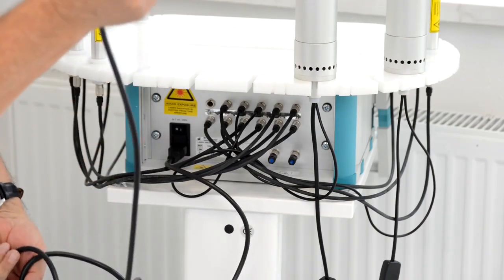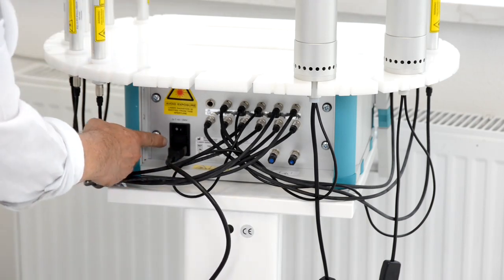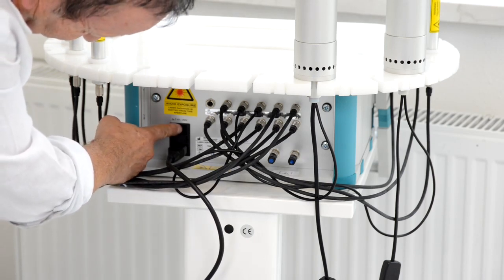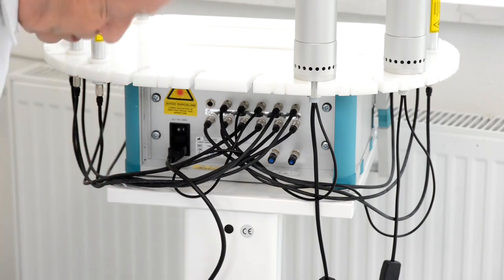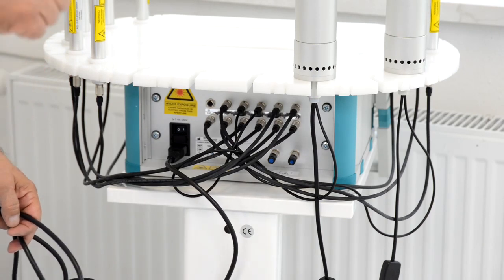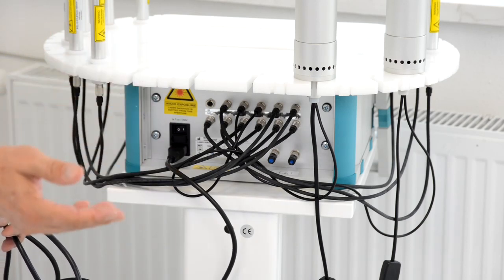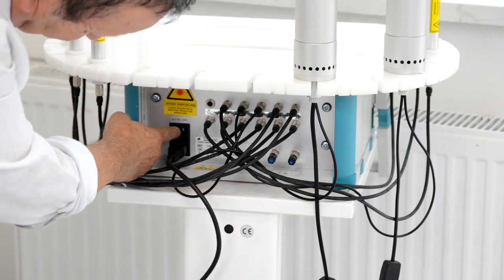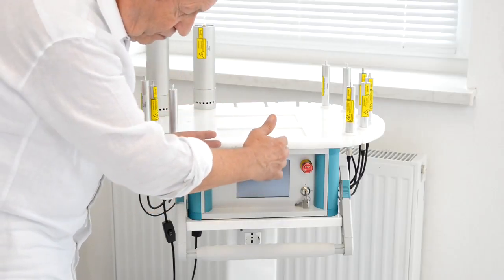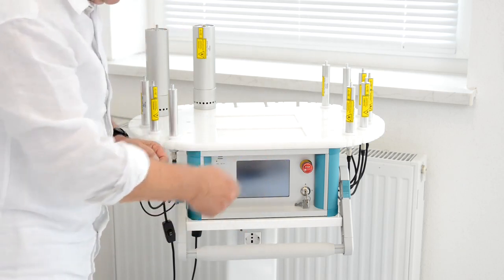and this will be plugged in for getting the electricity. On the back side is the main switch, which is now on 0, but to switch the device on, I put it on 1. And normally you can leave it on 1 because we have an additional key switch in the front. But if you are out of your clinic for a long time, then it might be better to put it on 0. Now I have turned the device again, so that I can show you exactly how it works on the display when we switch it on.